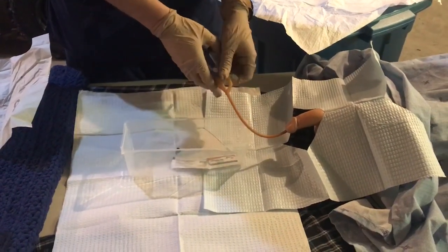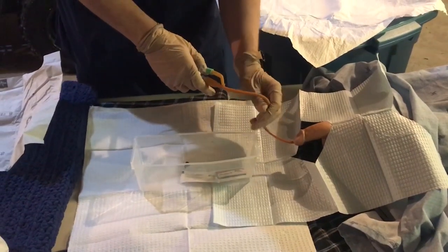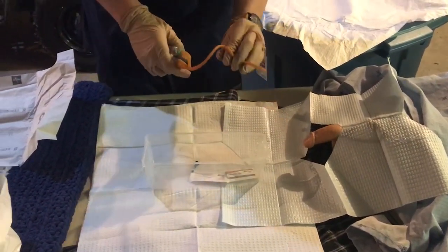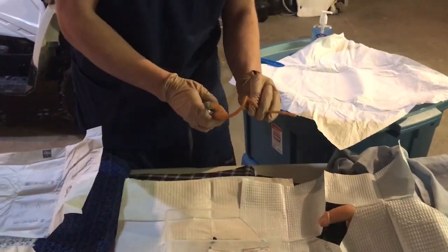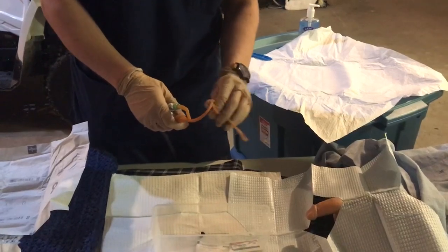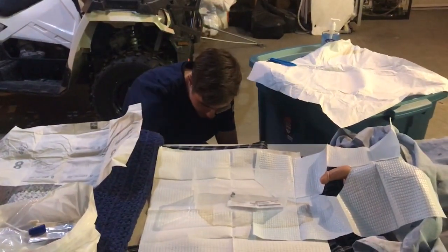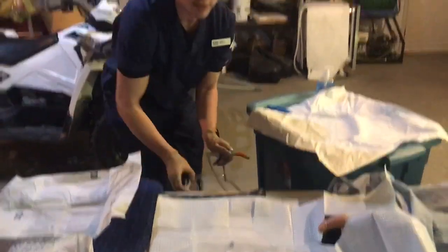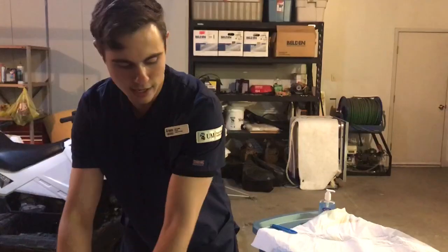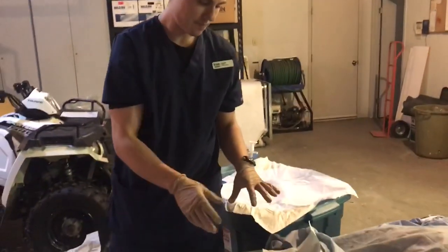Now I'm going to tell the patient to take a few deep breaths, that I'm going to be removing the catheter. So there we go, and it's out. I'm going to inspect the tip of the catheter to make sure that it's intact and nothing is left in the bladder, so that's intact and it's all good. Next, I'm going to throw this and the catheter and everything in the garbage. I'm going to clean up the bedside, perform pericare.